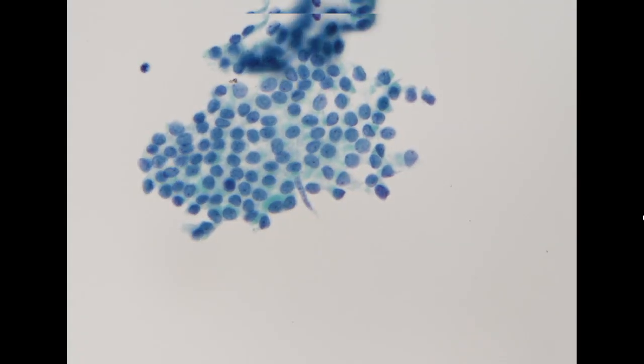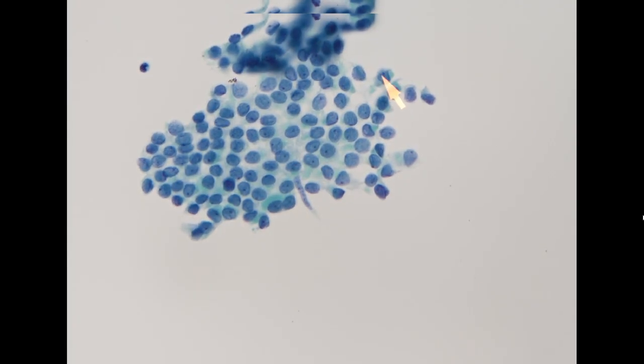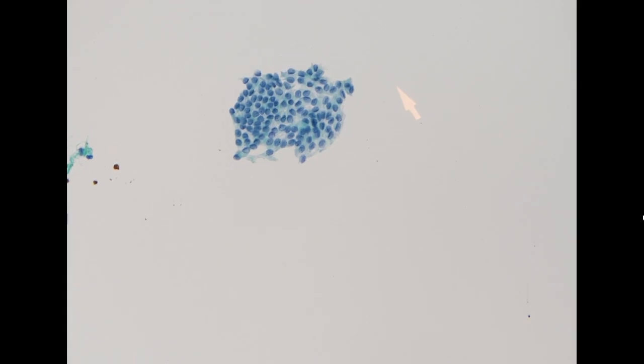Sometimes it's not very easy to identify a good pseudo inclusion. But here you can see this cell does have a notch over here and this sort of inclusion over here. What we call pseudo inclusion actually represents invagination of the nuclear membrane. So here we have a big notch, and if we see it from a different angle, you can see the pseudo inclusion inside the nucleus. So the nuclear features are consistent with papillary thyroid carcinoma.